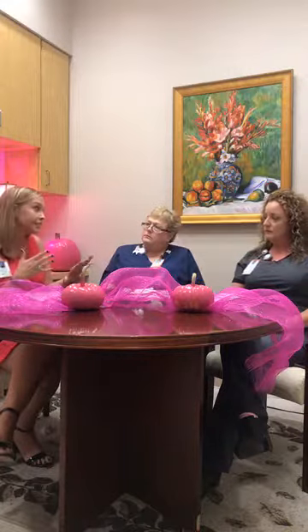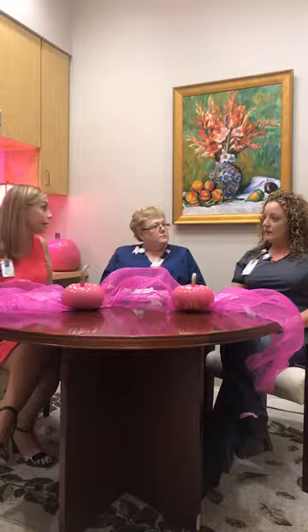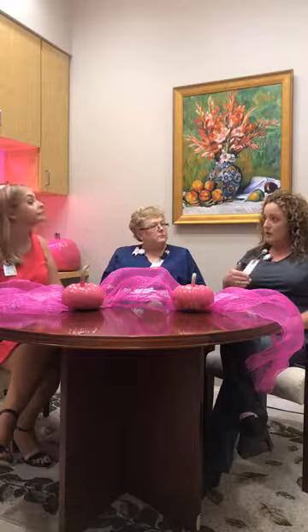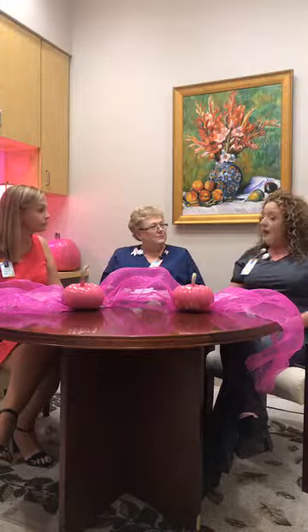Thinking about, sometimes women are a little sensitive certain times of the month. Is there a better time than another for a woman to come and get a mammogram? We as women vary, but for the most part, you're more sensitive the week before your cycle. Your breasts are more tender. You're not going to want me to compress your breast at that point of the month. So if your cycle is your normal cycle, I would schedule my mammogram the week after my cycle, not the week before.